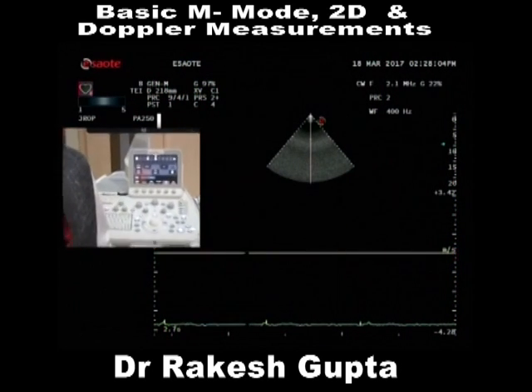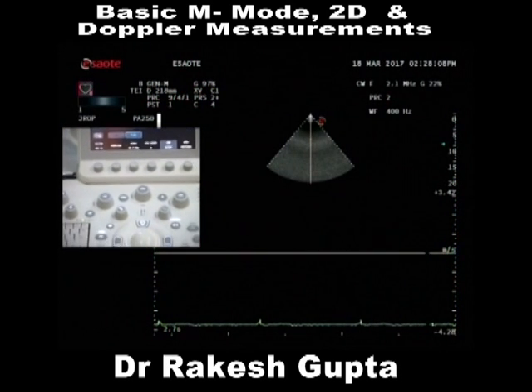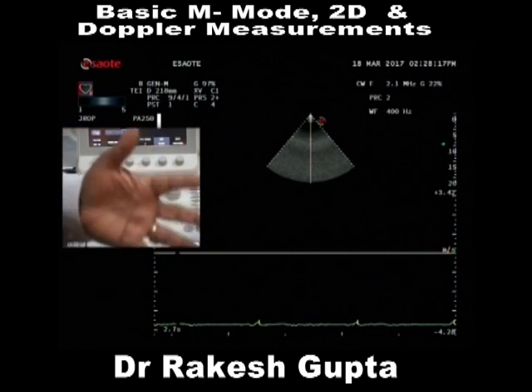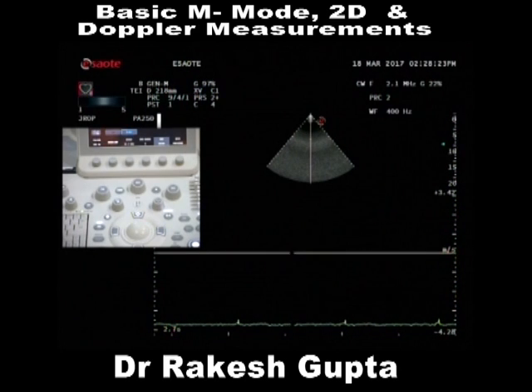Normally we put pulse wave. If the velocity is well within normal, we are not bothered. If we are not able to take care of it by the baseline, we can only change the baseline. If we can't do that, we switch over to continuous wave Doppler. Clear? Alright.